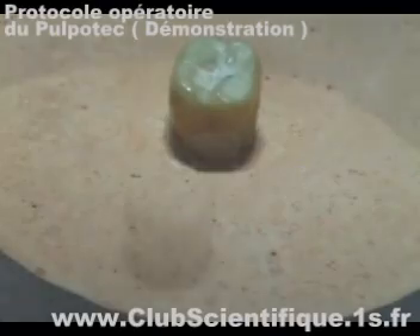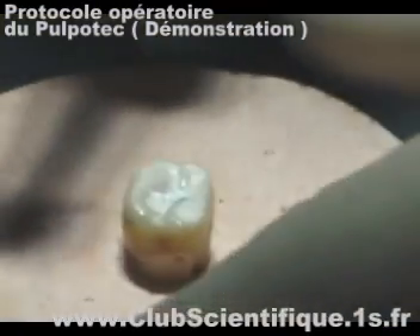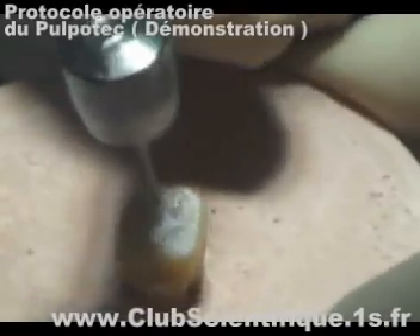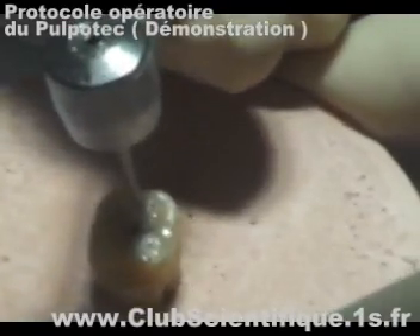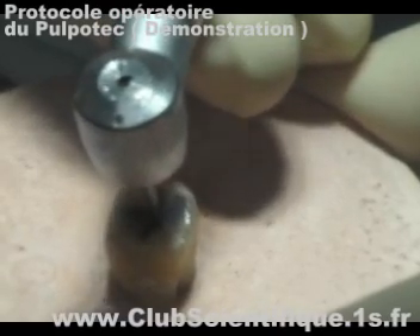Local anaesthetic has been administered. Pulpotomy should be carried out in the most classical way, that is to say, remove the roof of the pulp chamber with a tungsten carbide X-long tapered burr.